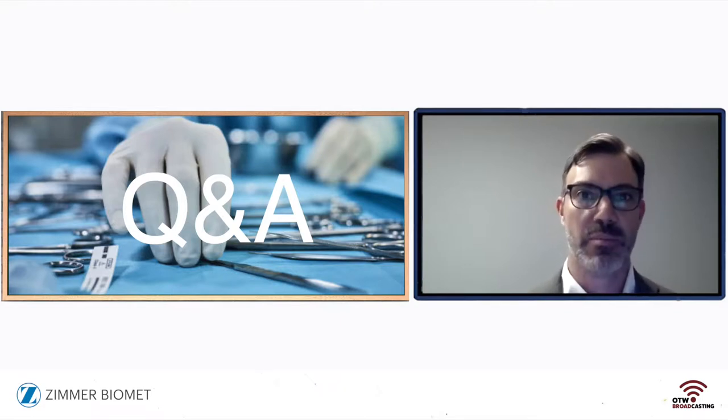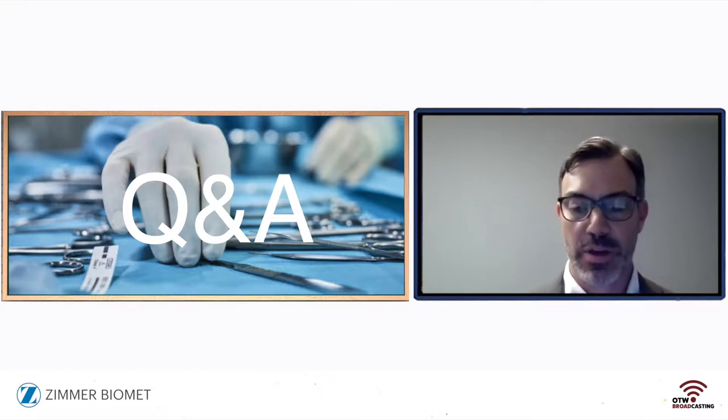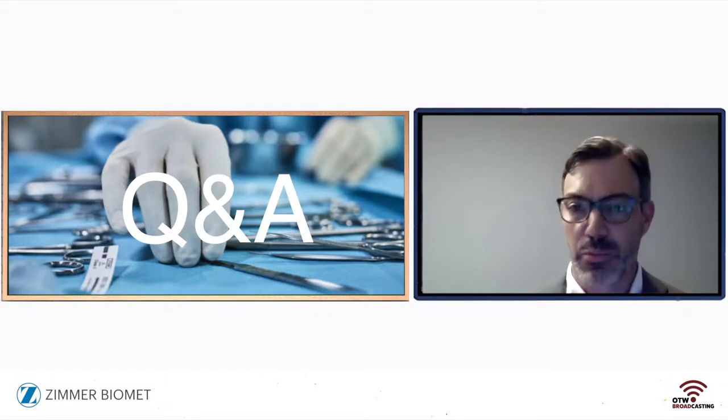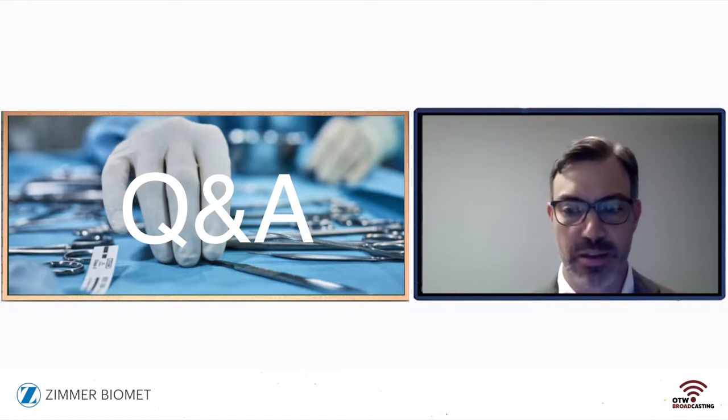I've always been of the mindset, if we're going to have to do some sort of surgical intervention for a patient, I would love it for it to be one intervention and be done. So if I can accomplish that with a VBT for someone who's got progressive scoliosis, I can have a conversation with the patient and say that 77% of the time, or roughly three quarters of the time, if the patient fits the criteria, they're going to have that success with one operation.